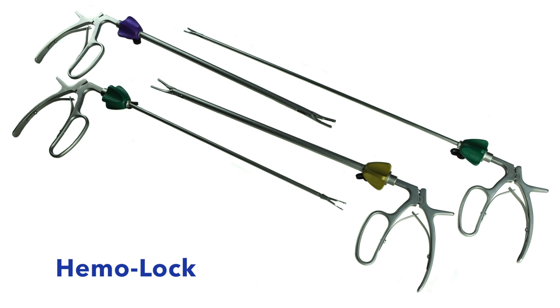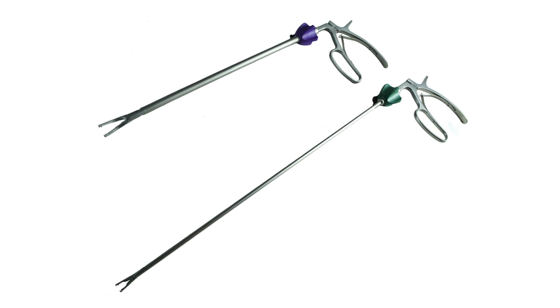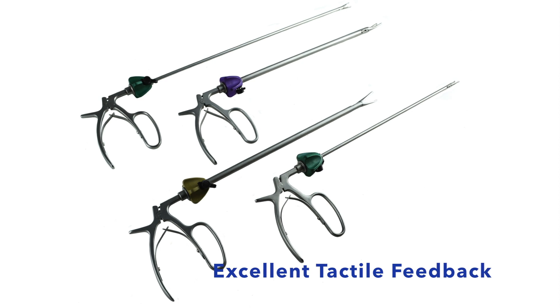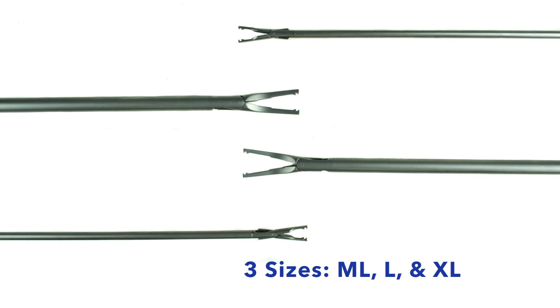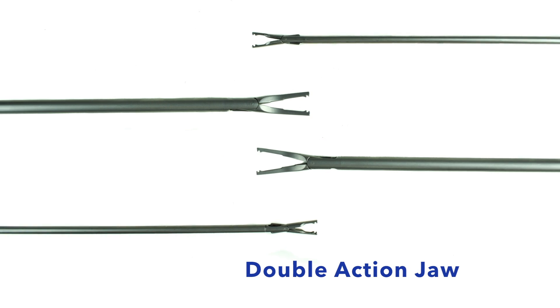AED's innovative Hemolock line of polymer clip appliers are ideal for polymer locking ligation clip systems. They provide excellent tactile feedback and secure excellent ligation of the polymer clips. The Hemolock clip appliers come in three sizes: medium-large, large, and extra-large, with a double action jaw.